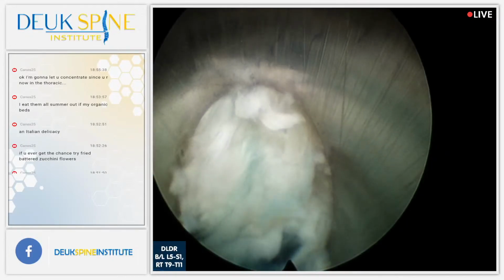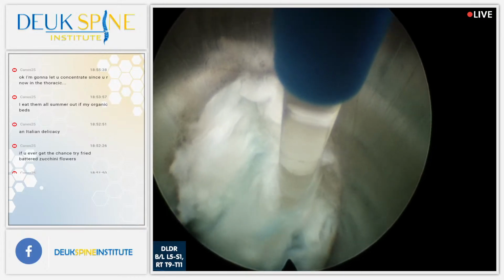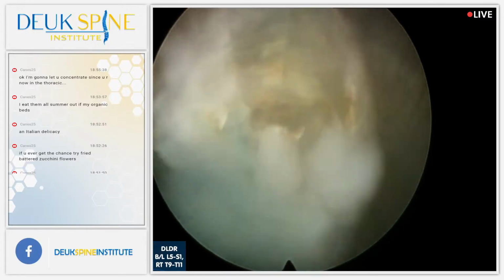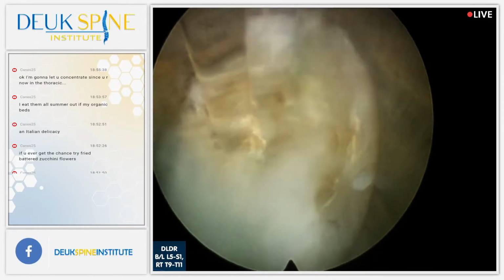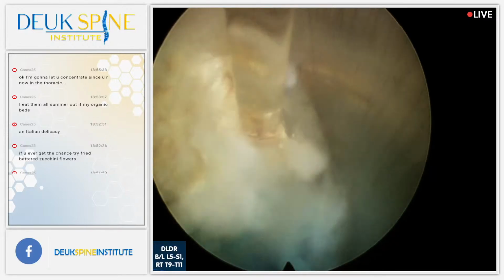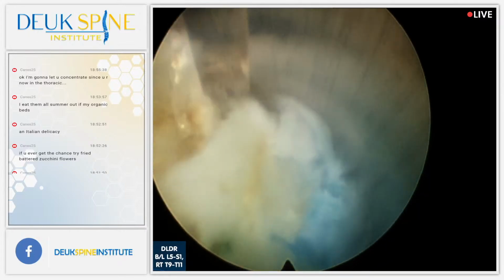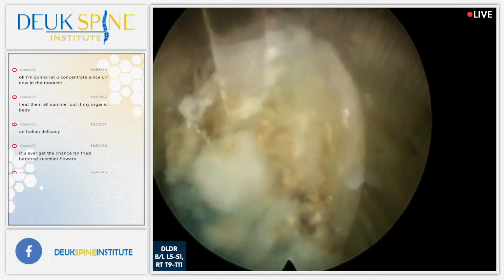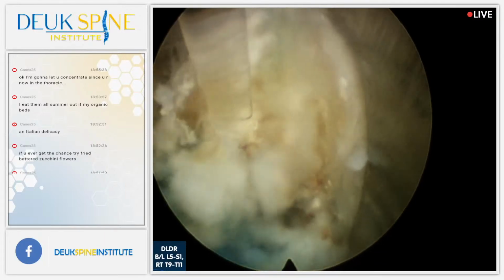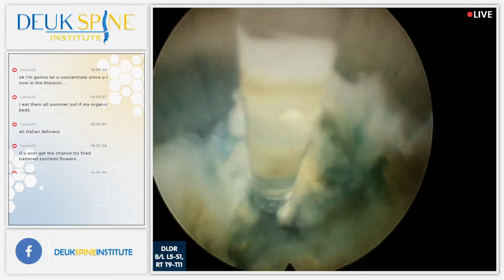Laser. Now, for those of you wondering what's the laser, this is a glass fiber. It's a fiber optic fiber. And all it does is transmit energy in the form of a wave called electromagnetic radiation from a laser generator, aka the laser, which is made in Israel from Luminous, best laser in the world. And it transmits that laser energy right here to the end of the fiber, where the herniation is. And look at all the scar tissue inside this disc. He's had this pain for years. No wonder. This is literally a 30-year-old injury to the disc. You can see it. So we did the right thing in fixing this disc. I have no doubt about it.